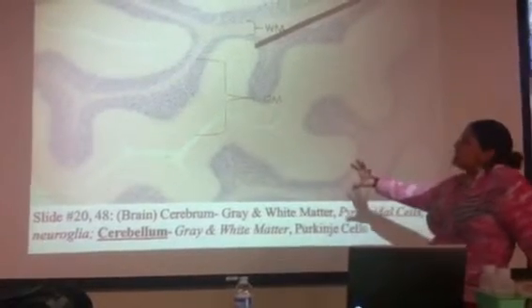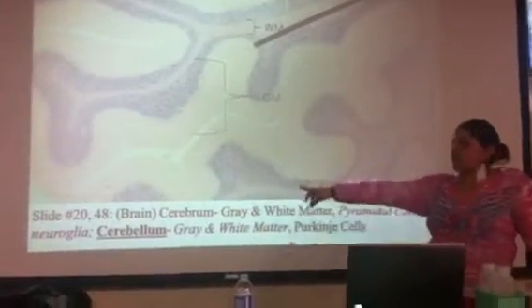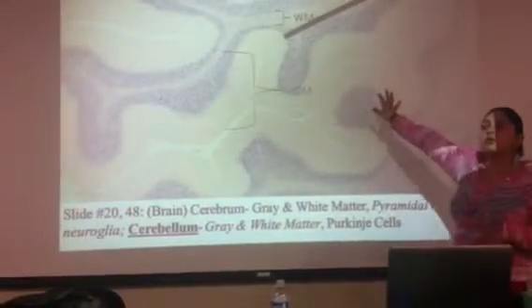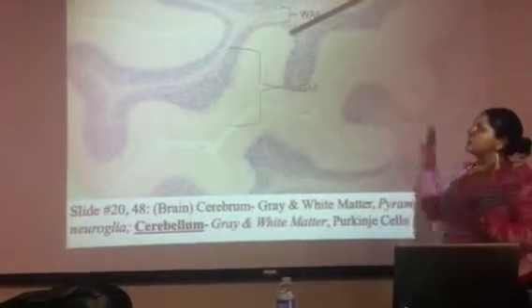So we're still on slide 20, guys. And this is also seen in slide 48. That's why I have slide 20 and 48 right there. This is now the cerebellum portion. When you see this, automatically this flower or whatever you want to call it, cerebellum.